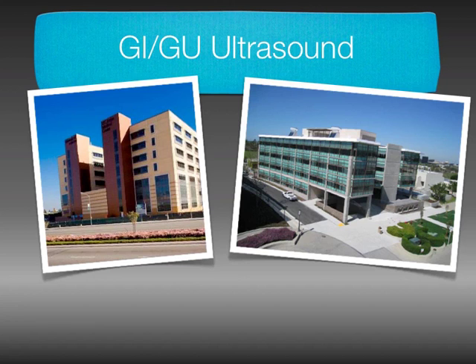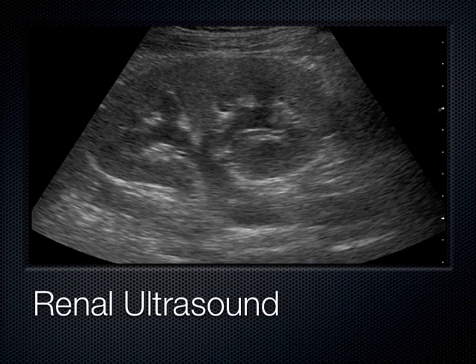So we're going to quickly transition today into the kidney and also some intestinal structures and the gallbladder. So this is the kidney, and you can see it here in all its splendor and glory. To talk about the different anatomical parts of the kidney, this is the capsule of the kidney out here. Now the capsule is a very rigid structure, and when the kidney expands, it's got nowhere to go, and so it causes the patient a lot of pain if the kidney gets obstructed.